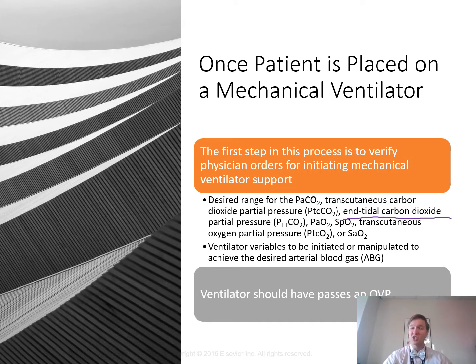And then even with oxygenation, so on ABG, CO2 looks at ventilation, and PaO2 and saturation look at oxygenation. So what are some vent settings that change ventilation? Well, vent settings that change ventilation include rate and tidal volume. Those are the things that we might manipulate to help improve mechanical ventilation and improve PaCO2 levels. What about oxygenation? Traditionally with oxygenation, we're looking at PEEP, mean airway pressure if you're on something like the oscillator, but PEEP and FiO2, right? PEEP and FiO2 are going to be your big ones to manipulate oxygenation while on mechanical ventilation.